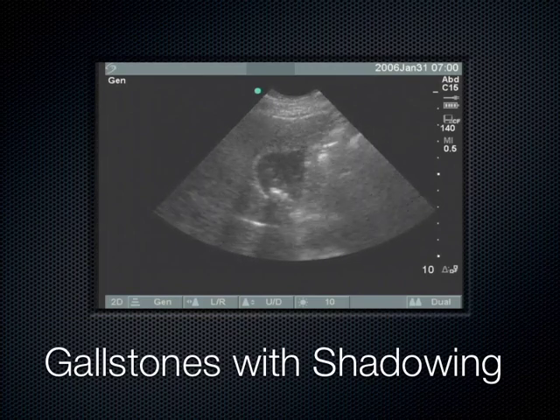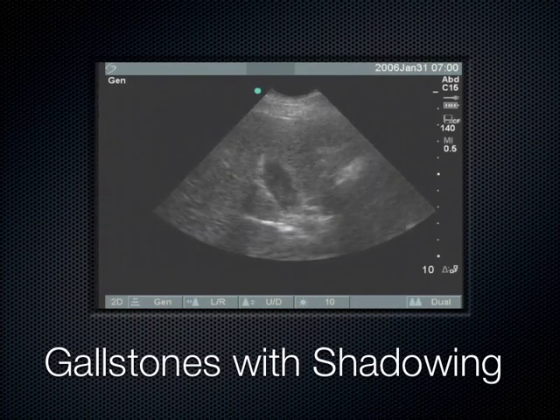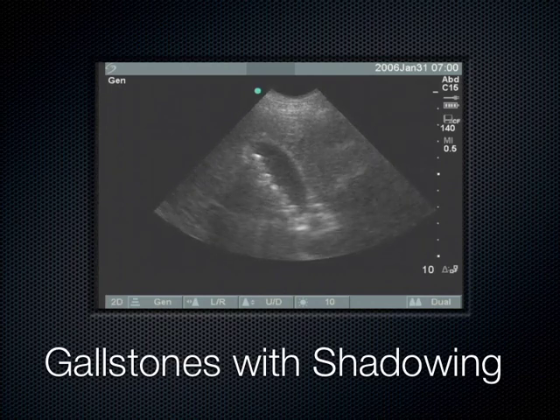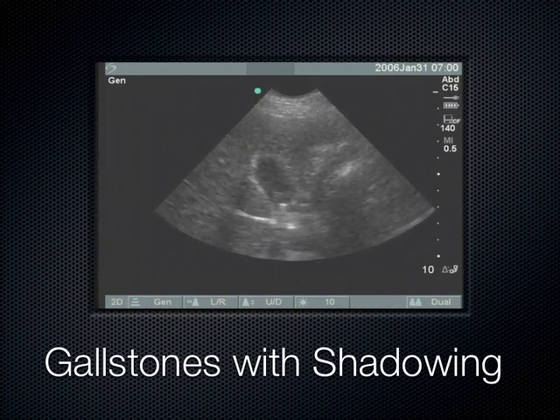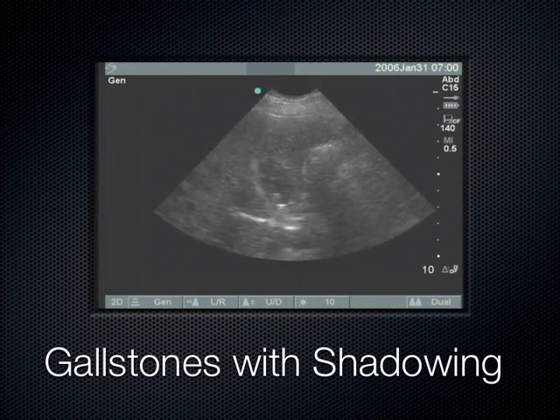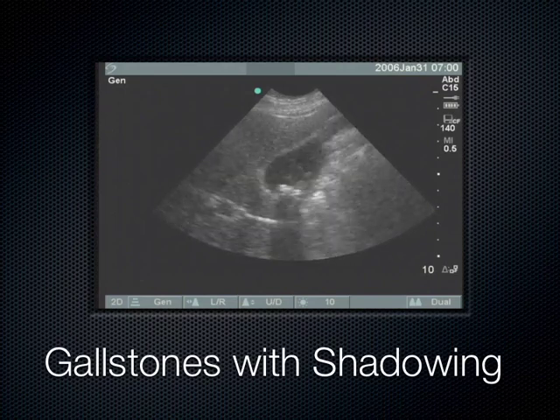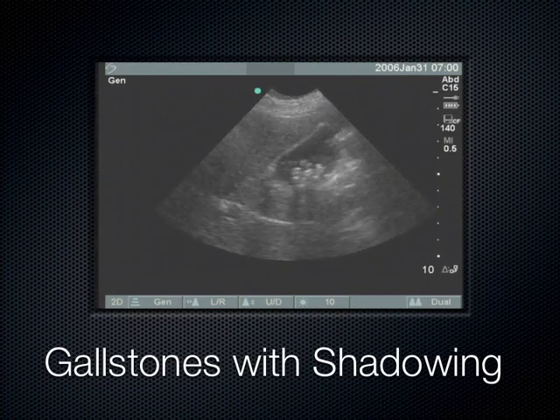And it's such an unbelievably common disorder in our patient population at UCI Medical Center that I would say, let's see, I saw one of my senior residents. Montessa, are you still in here? Yeah, it's such a nice day out too. Montessa, how often do you think we see gallstones in our emergency department? How would you describe it? Am I overselling it?